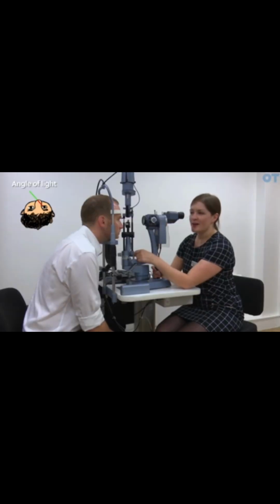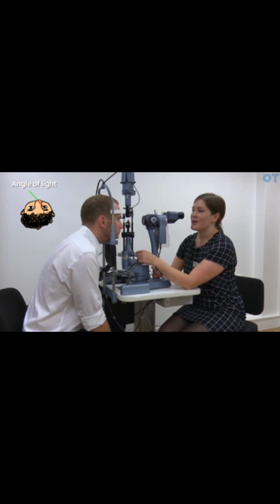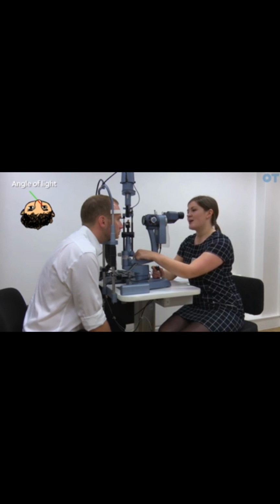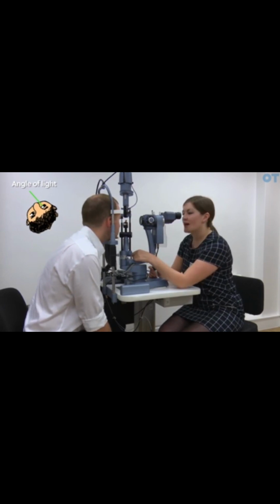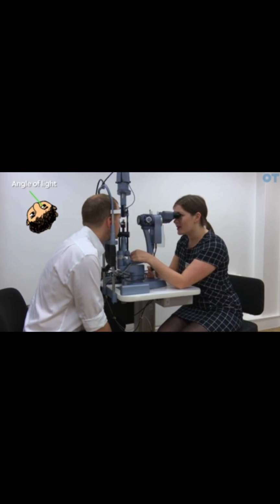And again, you're locking it at 60 degrees and you're placing the beam at the limbus. If you are aware that your patient's nose is obstructing the illumination system, you are able to ask your patient to rotate the head round while still looking straight ahead, like so. And again, placing the beam at the limbus.